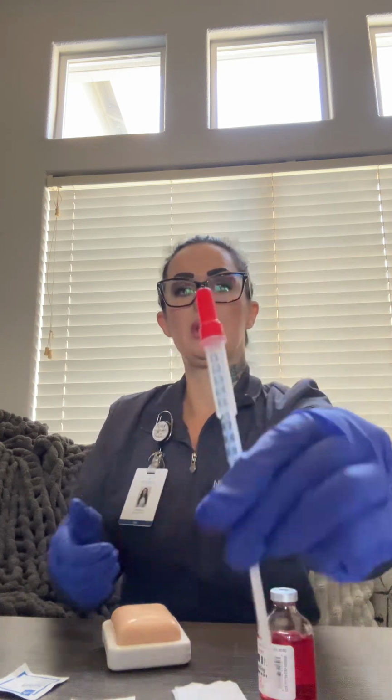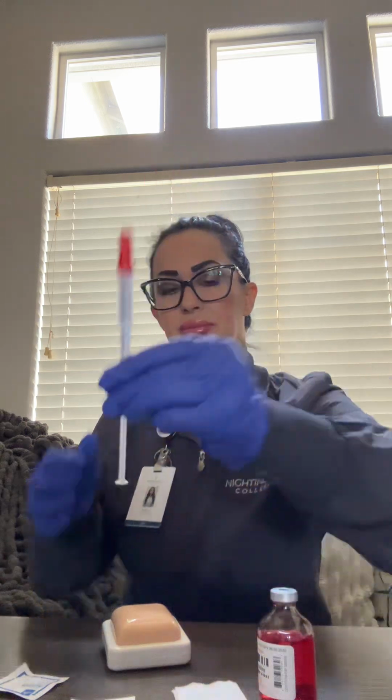I'm going to draw up the amount of medication needed, which is going to be the 1 ml. So this is going to be the air, and I'm going to put the same amount of air into the bottle.